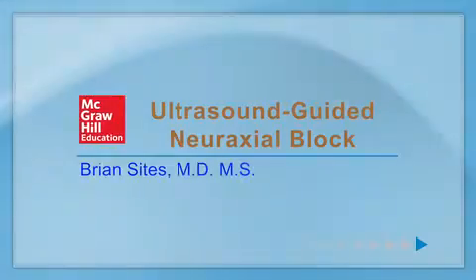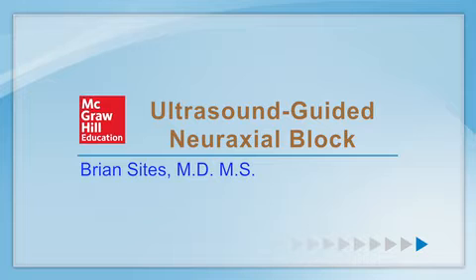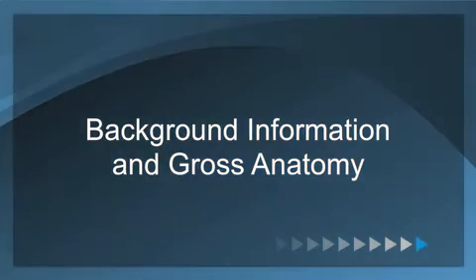Welcome to Ultrasound-Guided Neuraxial Block. Background information and gross anatomy.